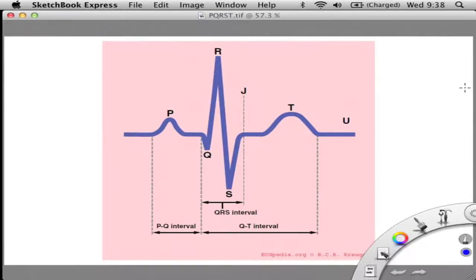The first thing you see up there, P wave right here. Can everyone see the P wave right in this area here? All right. So what the P wave is, well, let's back up just a second. Let's talk about the isoelectric line. That's the first thing you have to understand, the isoelectric line, and that is baseline. Everyone knows what asystole looks like. Just that one solid line, right? Well, that's an isoelectric line. It's just a baseline for it.